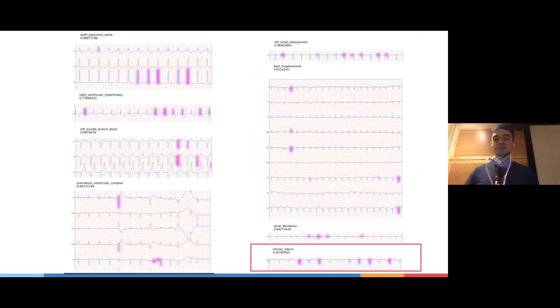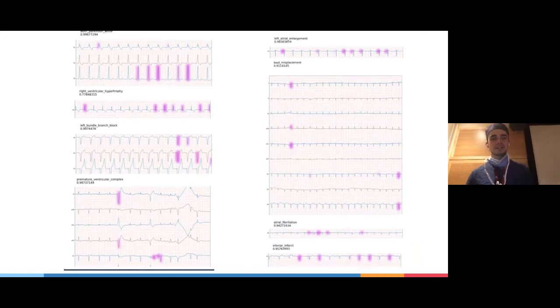So in short, this is interesting because AI learned to use the same features of the ECG signal that we as cardiologists are taught in medical school or in cardiology residency to diagnose disease, but it learns so by seeing a ton of examples without understanding the underlying physiology. So this shows that our understanding of what is a Wolf-Parkinson-White on ECG is true, and AI is using the same thing, but it learned on its own by seeing a ton of examples.